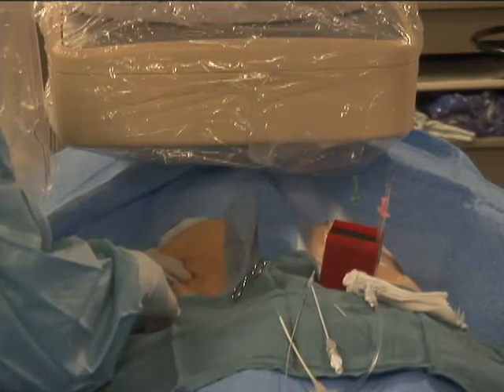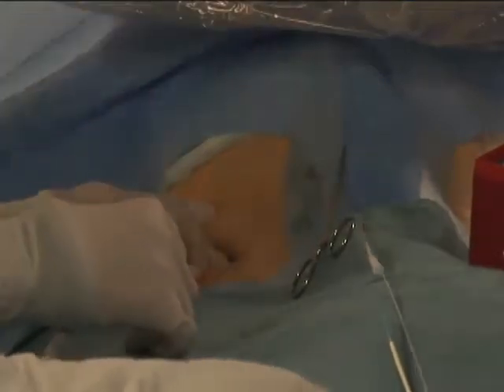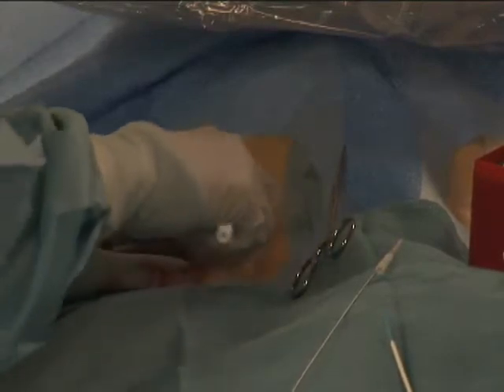The artery is palpated with the left fingers, and the artery is stabilized between the fingers. The micropuncture needle is advanced at the predetermined skin puncture site until the artery is entered and arterial blood is visualized within the needle hub.